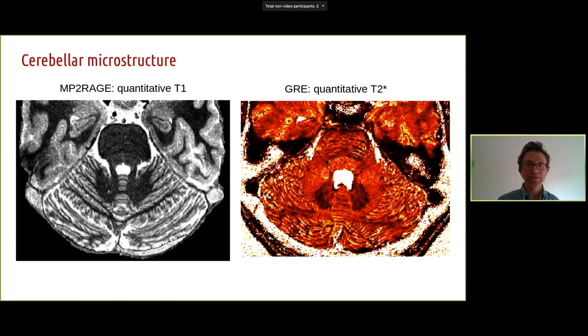Last but not least, if you have some high resolution quantitative MRI, for instance, with 7T, like Wietske van der Zwaag nicely presented in her talk, you can start looking at how those are distributed on the cerebellar surface. In the volume, things being very packed, it's very hard to find patterns.